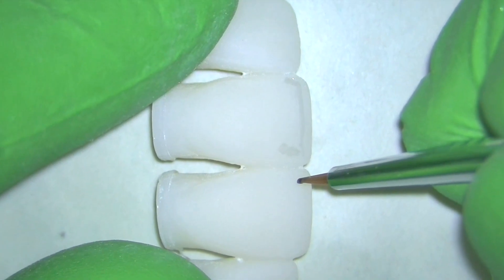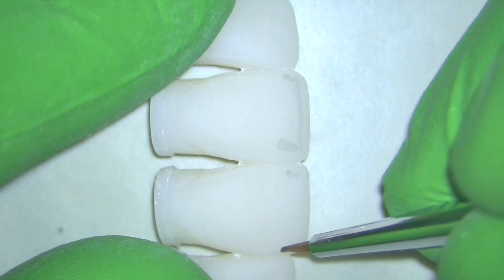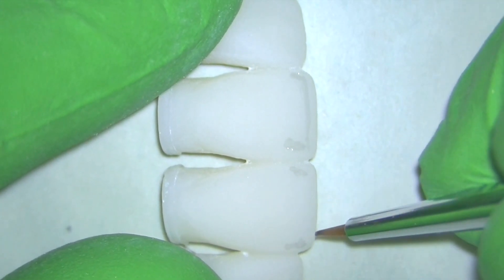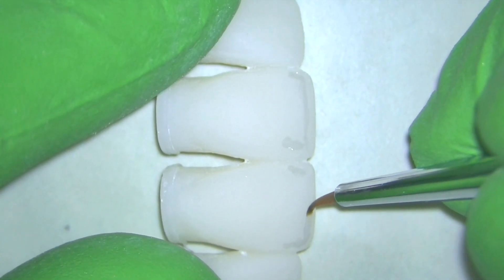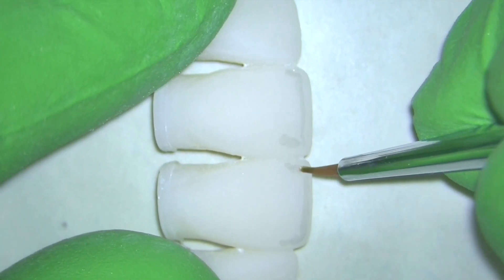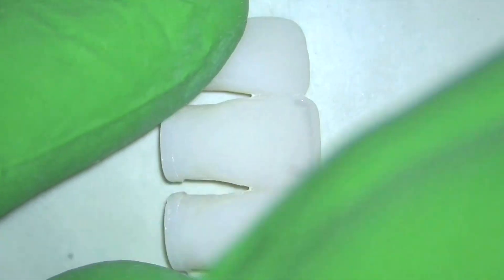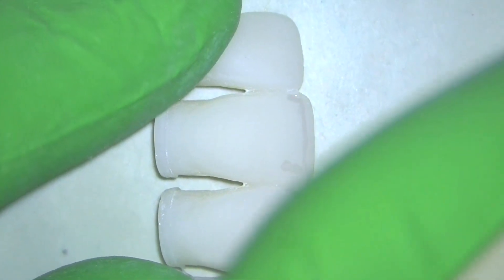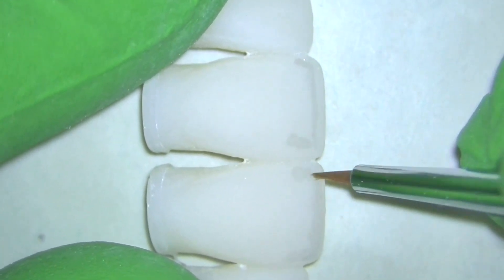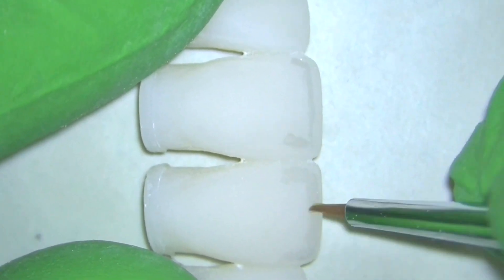I'm going to add those two points of stain kind of on the proximals just below the incisal edge, and then begin to work it throughout the rest of the tooth. Once I've added what I want onto that tooth, I'm going to wipe my brush off, get a clean brush, and then just work on diffusing what stain I've already put on the tooth.